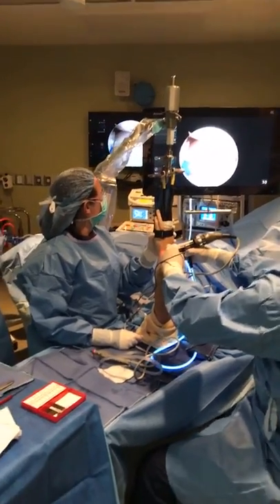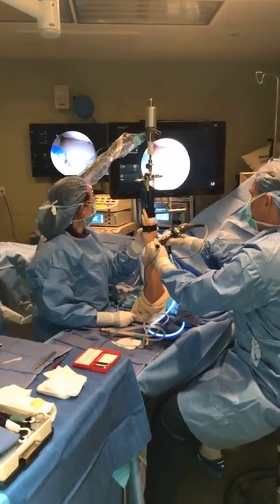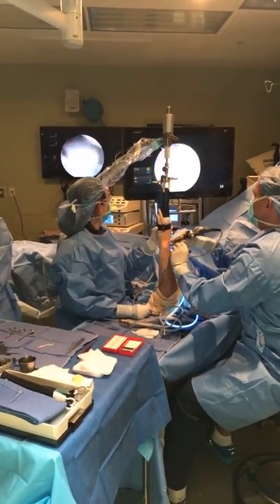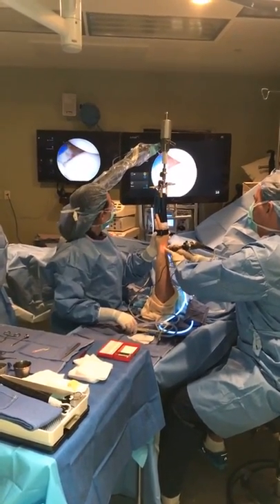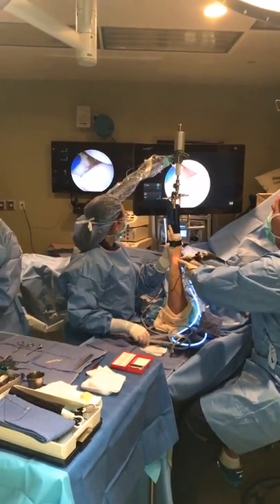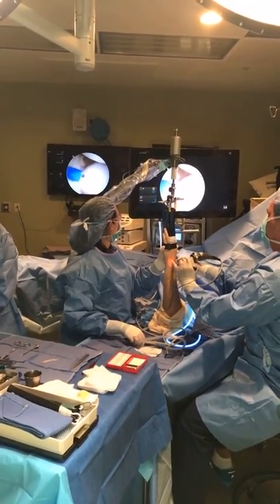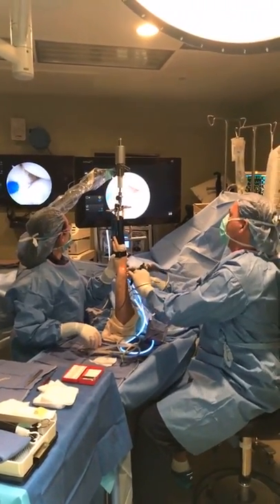Okay, so what this radiofrequency does is it tightens up this tissue. You see, I touch it, and it eliminates a lot of this fraying and what I call redundancy. You have to know how to use it though, because it can have some ill effects, so you have to be very careful. But you can see now, all of a sudden the red is gone. The red, that synovitis, represents pain, essentially. So this is basically taking the pain away. That's good. I don't want to do too much.